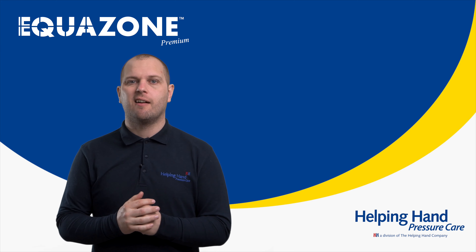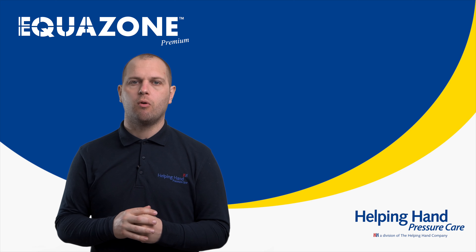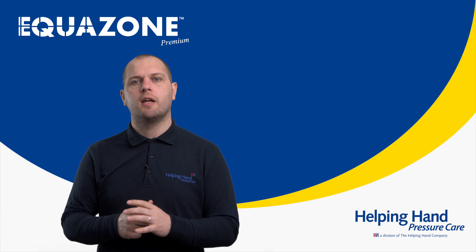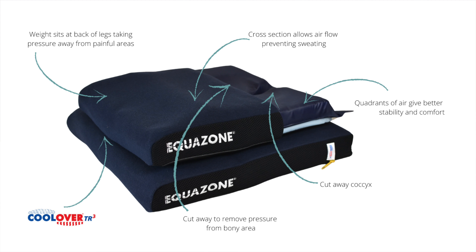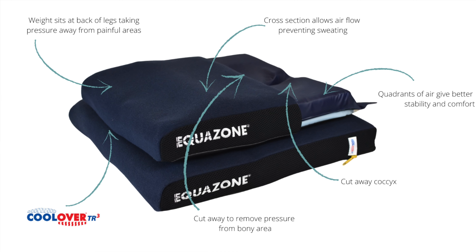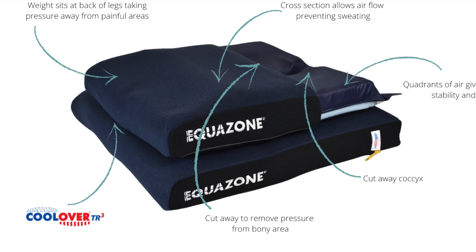The Equazone Premium is our low-profiling, very stable, high-risk air cushion. The Equazone cover is slightly different to other cushions. As you will see, the brand name is embroidered on the side and all cleaning instructions are on the label inside the cover.